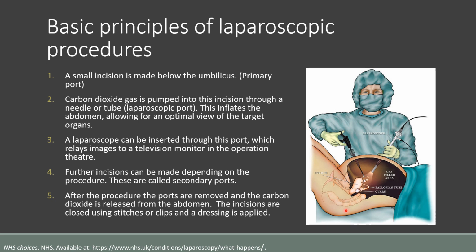So that's essentially a basic rundown of laparoscopic procedures. Obviously, this is a lot more complicated and will differ according to what procedure is being conducted. This presentation will be focusing mostly on these laparoscopic ports. So what are laparoscopic ports? What makes up a laparoscopic port? I'll also be discussing a little bit about laparoscopic port placement, and then we'll end on some complications that can arise at laparoscopic port sites.